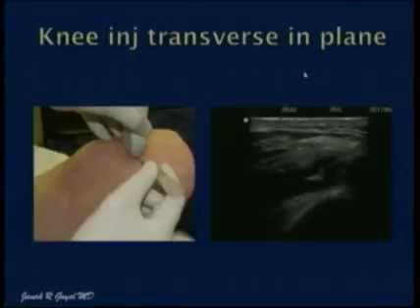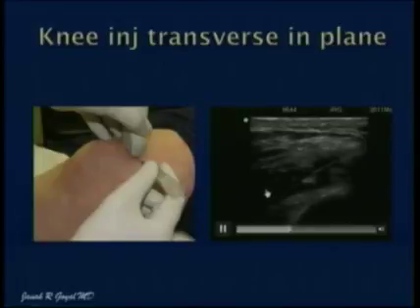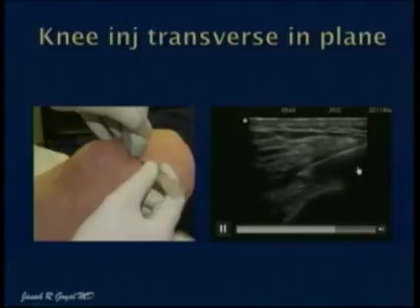This is a transverse approach, again in plane. So I'm trying to aspirate the fluid from this suprapatellar recess. But if there is no fluid, I usually use the out of plane approach.